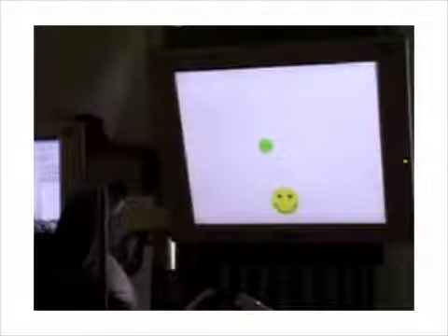After extensive training, as we can see here, the patient is able to perform a variety of tasks, such as moving the cursor to designated targets or opening a file in an email, by imagining the movement. While this is remarkable, the levels of device control have yet to match the action of a human hand using a computer mouse, and the long-term stability of electrode arrays is a serious limitation. Significant work is still needed to create devices for long-term human use.